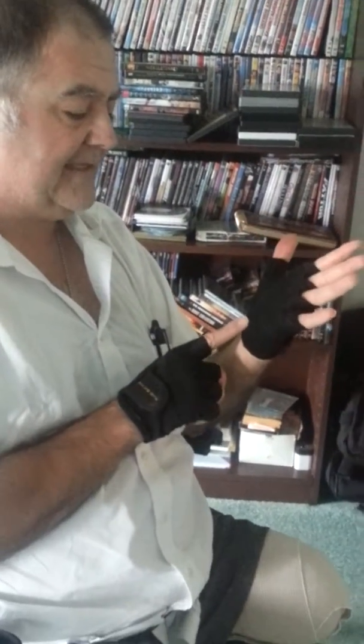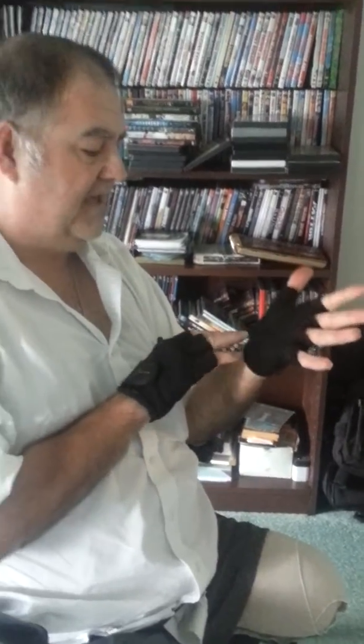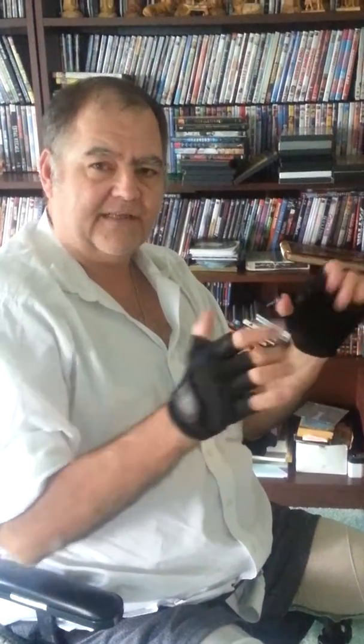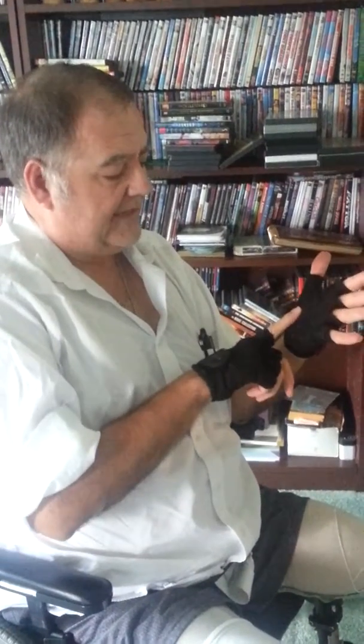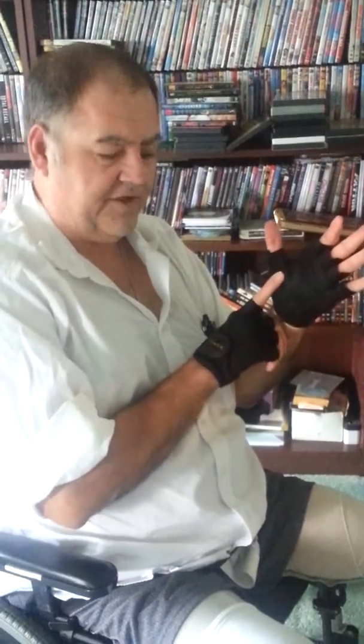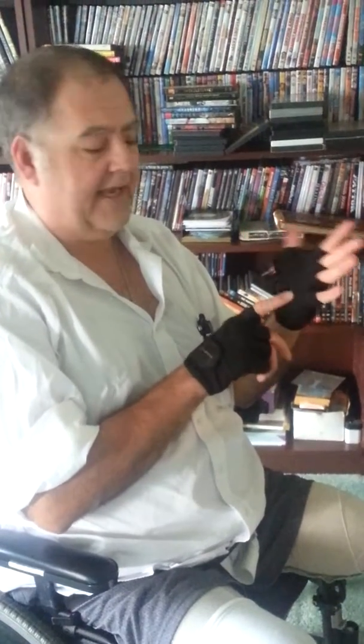My suggestion is that you want to buy gloves that are tight-fitting to your hands. I like these with no fingers because I can still use my fingers with the gloves. And these are pretty inexpensive. They're not wheelchair gloves. I just went to the sporting goods section of Target or Walmart, near where the weightlifting stuff was, and they were like $10 or $12 for a pair.